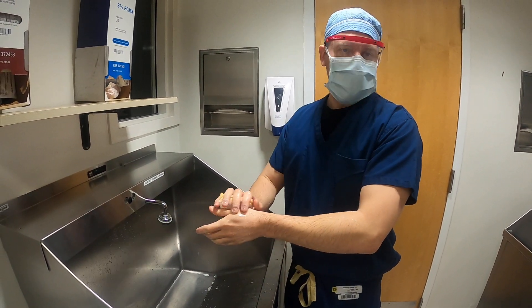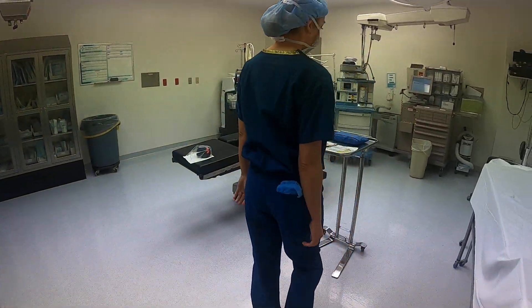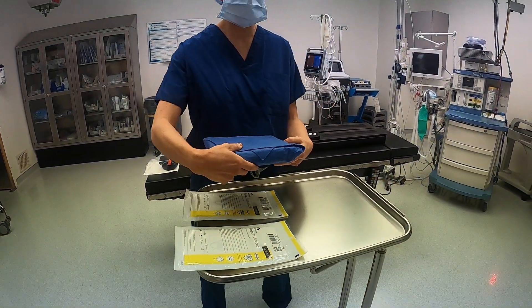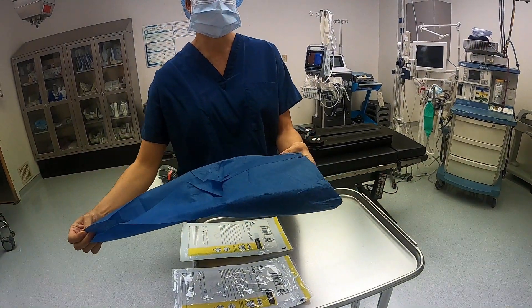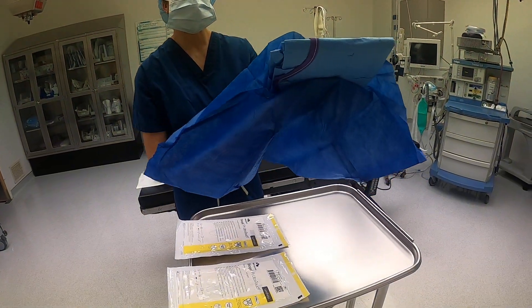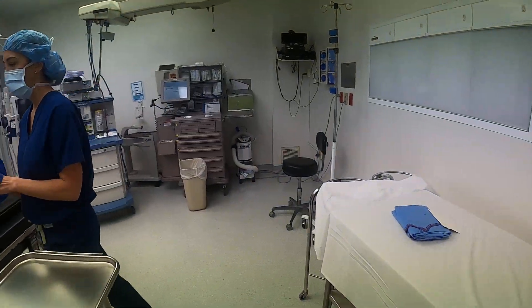While finishing scrubbing in, we're going to show you how to open up your gloves and gowns in the room. When you're opening your own gown, the gown has already been taken out of its sterile pack but not completely unwrapped. There's a triangular tab — take that tab, pull up and out. You'll find another tab, and then another tab. Now you have your sterile gown inside. Pull the packaging back out of the way, and drop your sterile gown onto your back table. The packaging gets discarded.